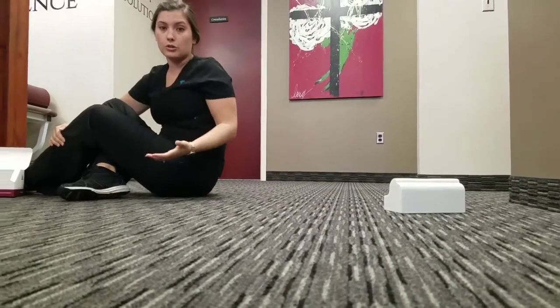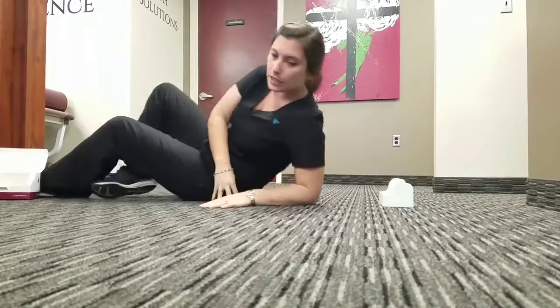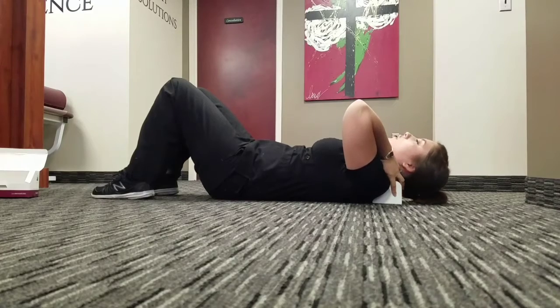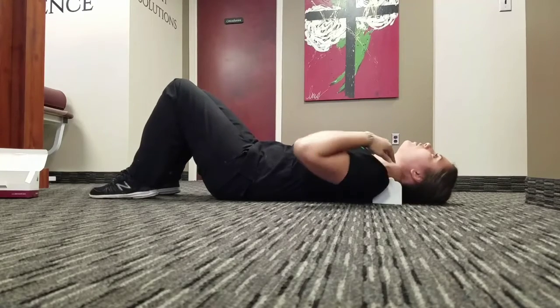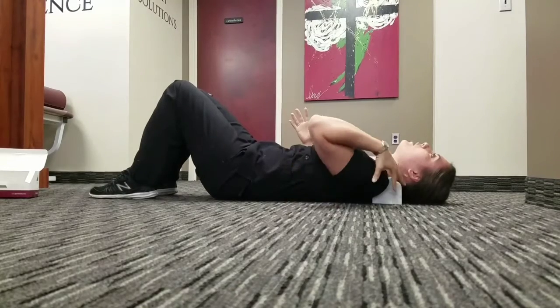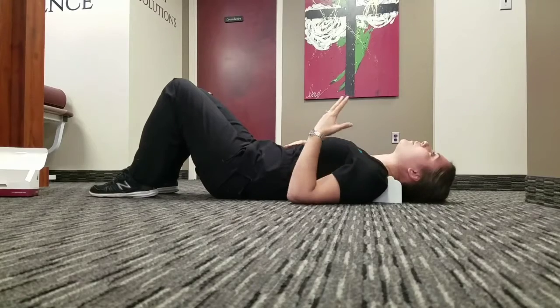Now, if you're going to do your middle neck, it's the same concept. So you're going to have the pillow placed here, and you're going to lay back with the middle of your neck over the pillow, just like so. Again, it's helpful to have someone there with you the first time just to make sure you have it in the right position. And then again, you'll remove it the proper way.